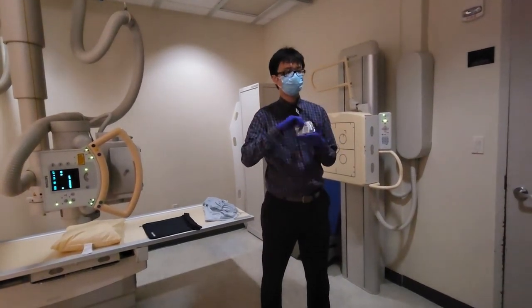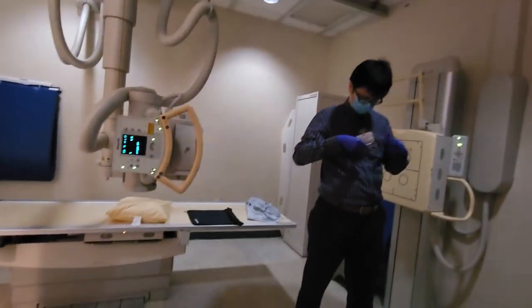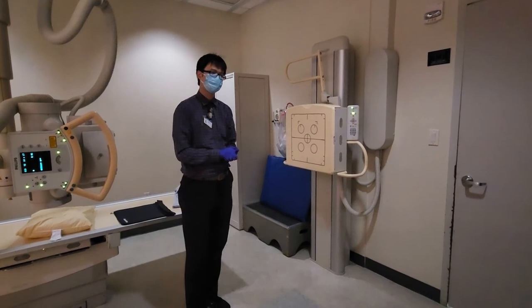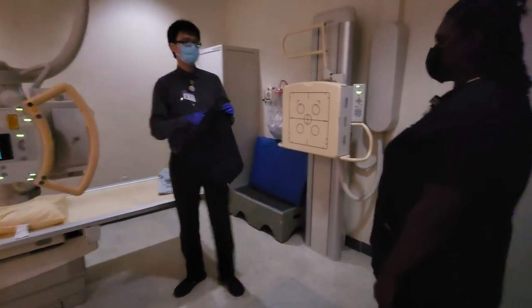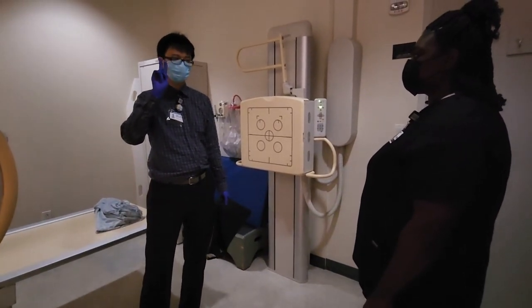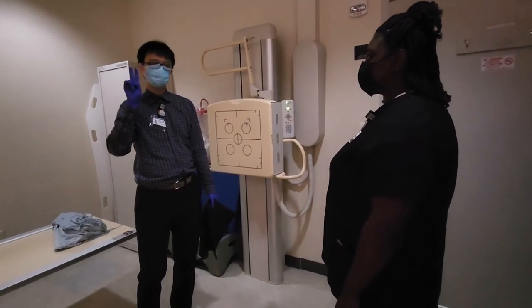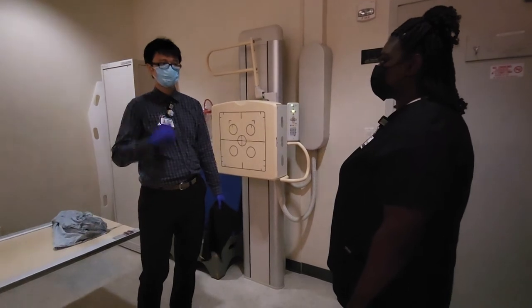I want to make sure I have my left and right markers. Who would like to be our first volunteer as a patient? We are going to start with the PA chest. If you look in your lab syllabus, you will notice there are two projections labeled as mandatory — everyone will perform these two projections during lab test-out. They are the PA chest and the lateral chest. Together, these two projections form your routine chest exam. If a patient comes in for chest x-rays, you're almost always going to do PA chest and lateral chest.